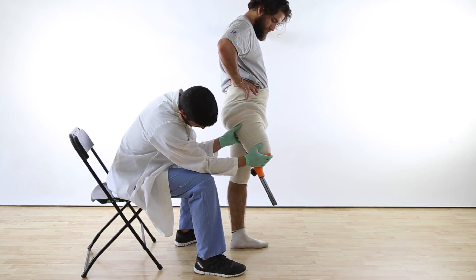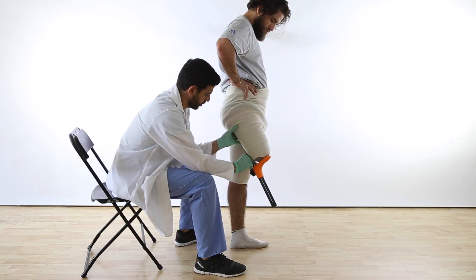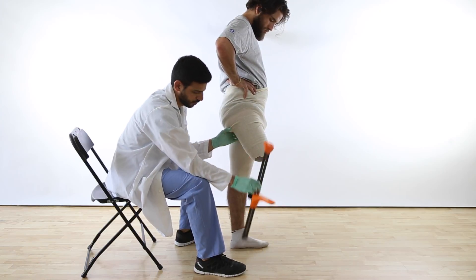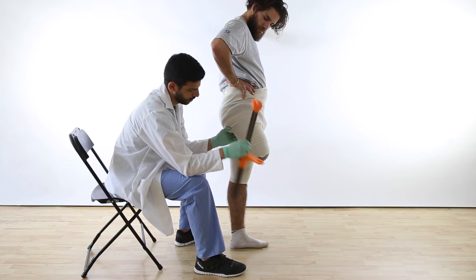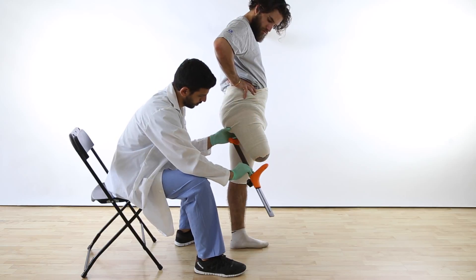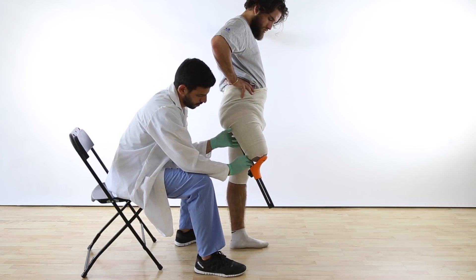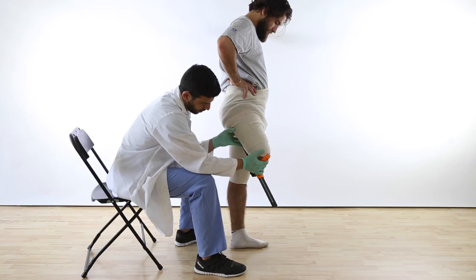Adjust the distal plate to match the patient's limb length. Before removing the tool, relocate the ischium with the hand to maintain position, then get your length reading. The purpose of this is to maintain consistent measurements off of the same landmark.